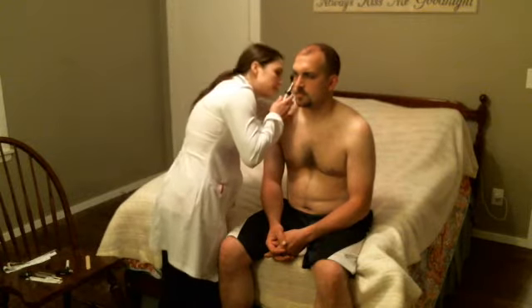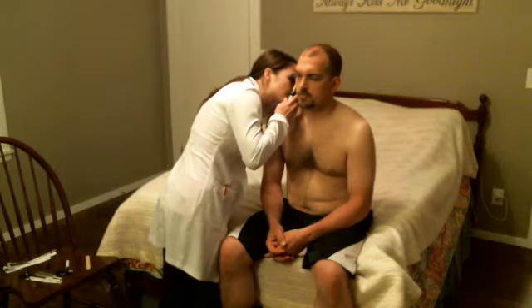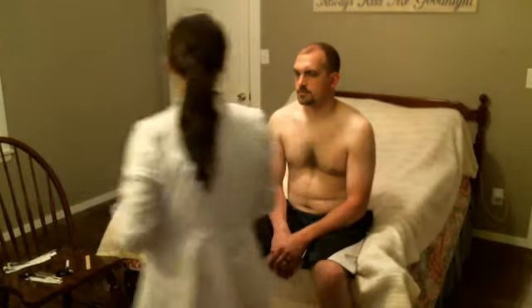There are no perforations, and I can see the landmarks bilaterally. This ear, I can see all the landmarks. There's no redness. There are no perforations noted. It's nice and pearly gray. Same with this side. There's no redness. There's no exudate. There are no perforations. This tympanic membrane is nice and pearly gray. And that side as well.